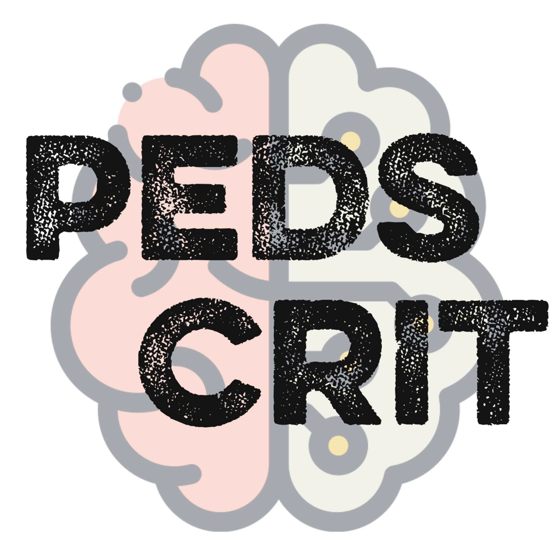But as I mentioned, this is an area where the differences between the modes should be explored. It's more the habits of the unit. Also, it can facilitate the transition to extubation, because then you just pull the tube and go back to NAVA and continue like that. So for the weaning phase, it may be helpful too. I will say, just in our local practice, we use NAVA infrequently.